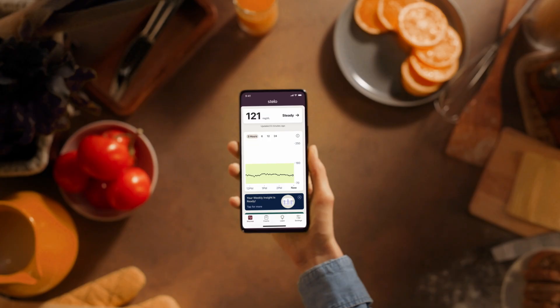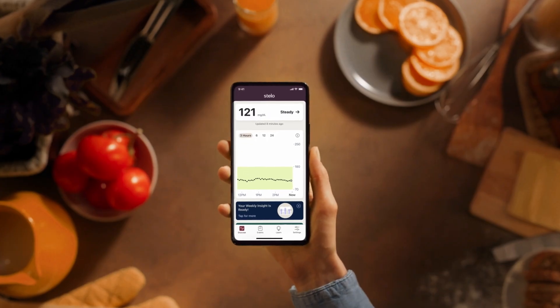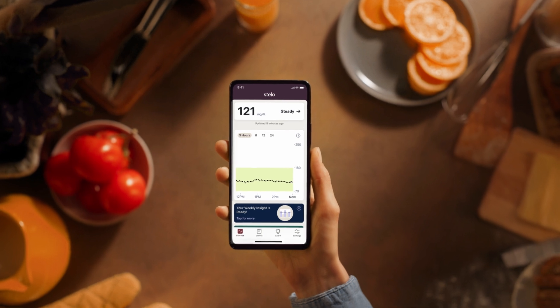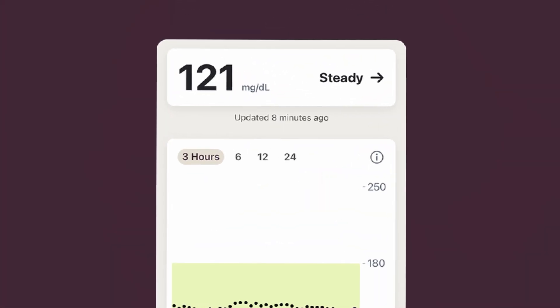Reading your glucose all starts with reading your number at the top. That's your current sensor reading. It tells you where your glucose is and updates every 15 minutes. Under the number, you'll see the update timer. This is when you received your most recent reading.